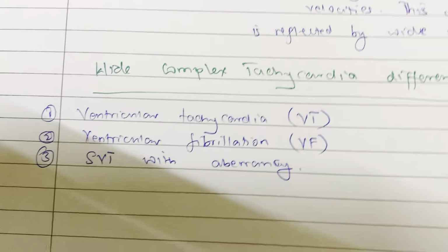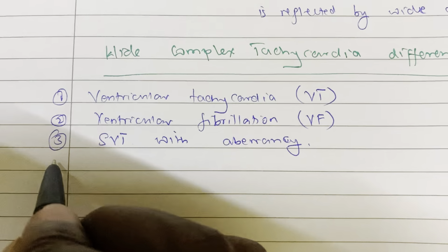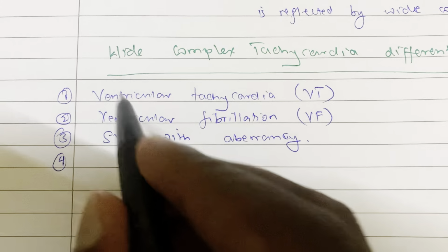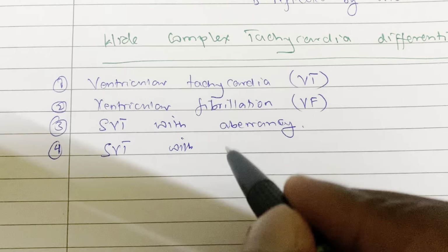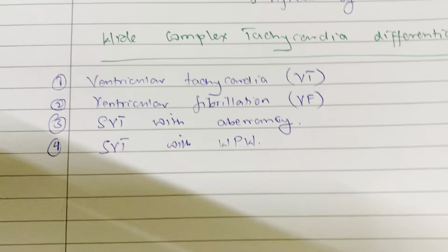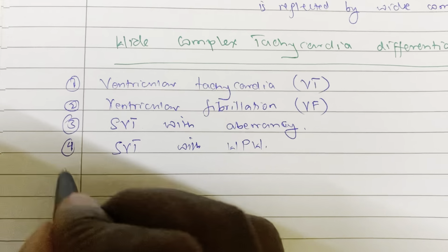So two, yeah, four, SVT with WPW, leave that one there for now, nothing much to add.